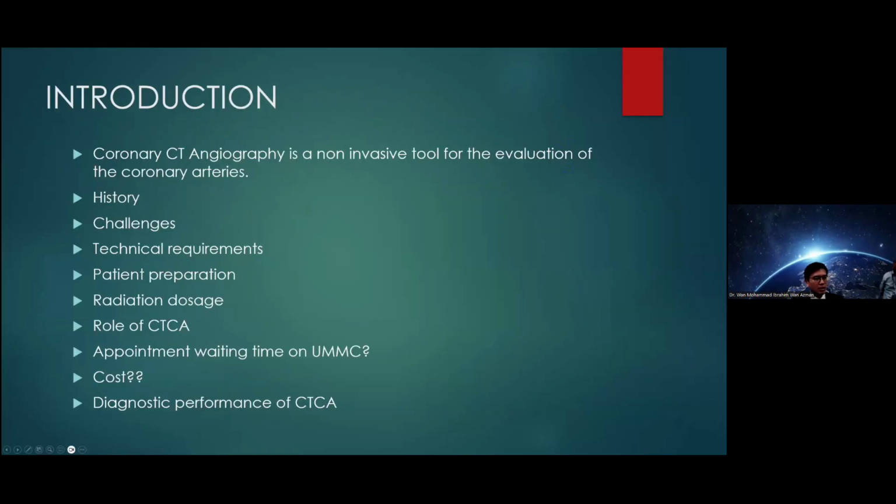So what is it? Basically, CT angiography is just a non-invasive tool to evaluate your coronary arteries, the four major vessels in your heart, which is the left main, the left anterior descending, the right coronary artery, and also the left circumflex arteries.